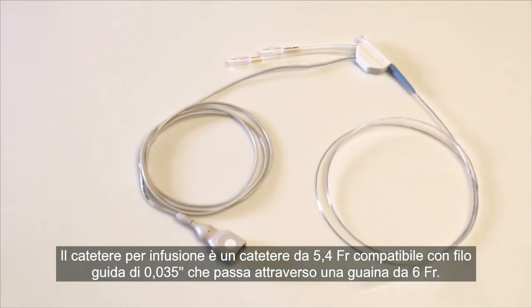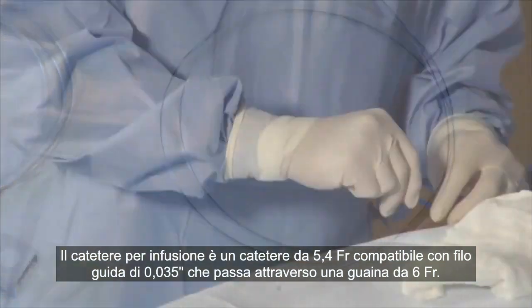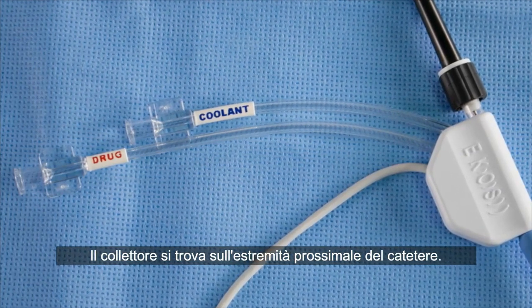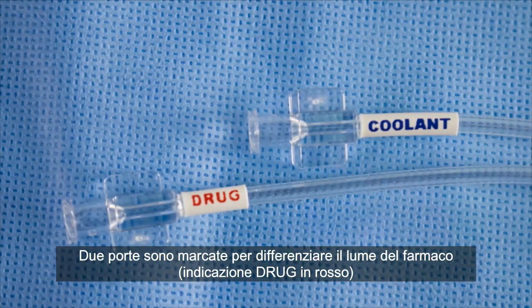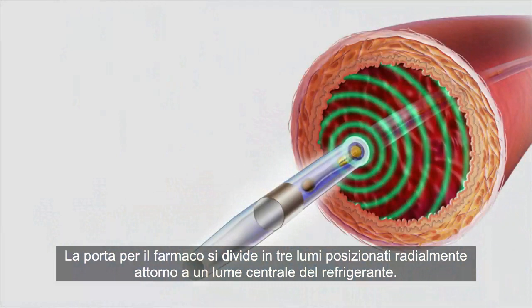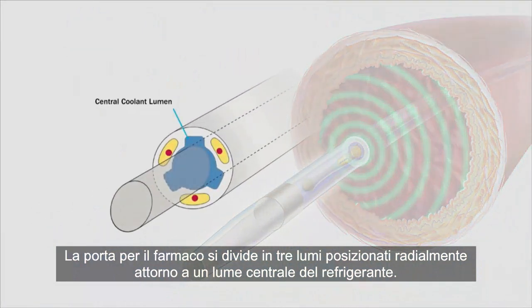The infusion catheter is an 035 guidewire compatible 5.4 French catheter that will go through a 6 French sheath. The connector assembly is located at the proximal end of the catheter. 2 ports are marked to differentiate the drug lumen, labeled drug in red, and the coolant lumen, labeled coolant in blue. The port labeled drug splits into 3 lumens that are located radially around a central coolant lumen.